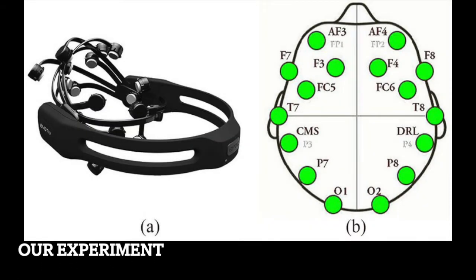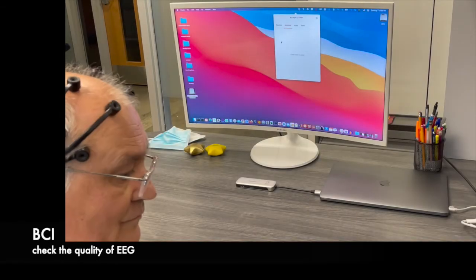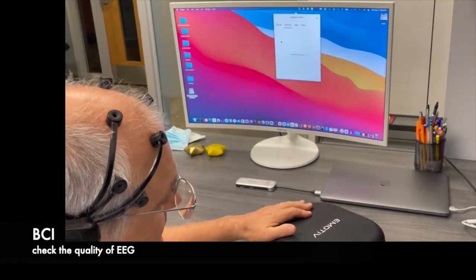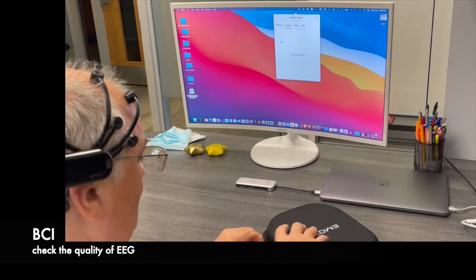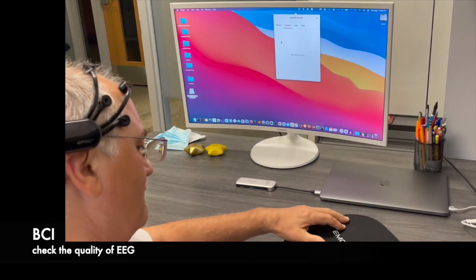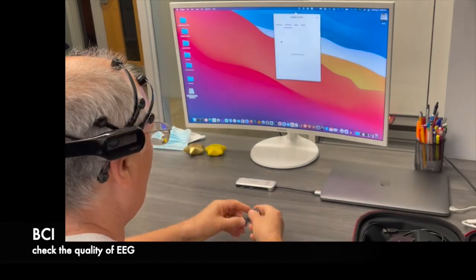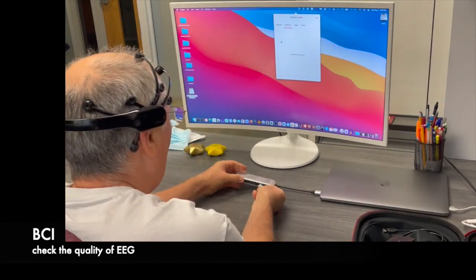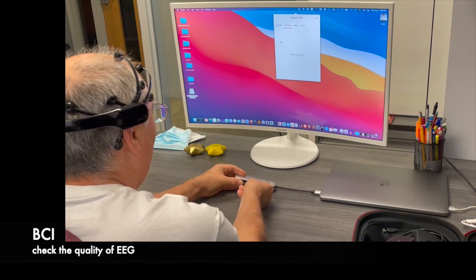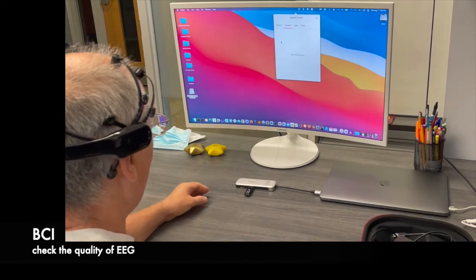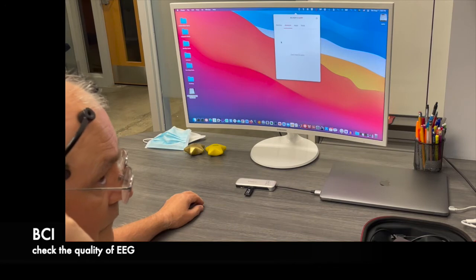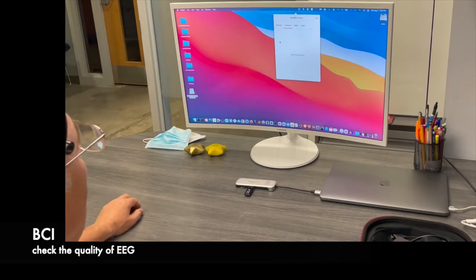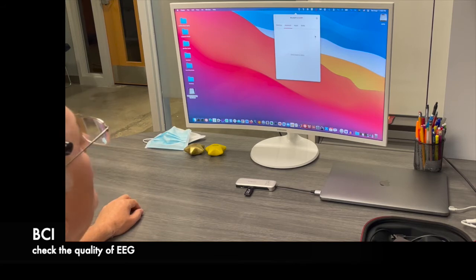So let's see the experiment that we carried out. So first, I check the quality of the EEG signal. As you notice, I opened the application. I need to connect the unit with the USB dongle to my computer now and start the unit and now I need to connect it through the software.